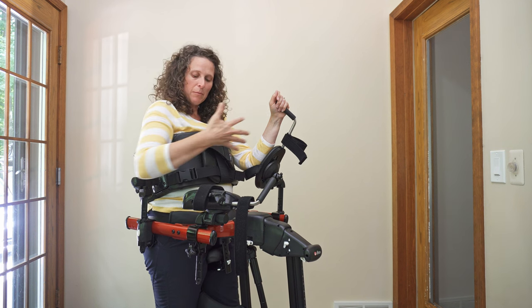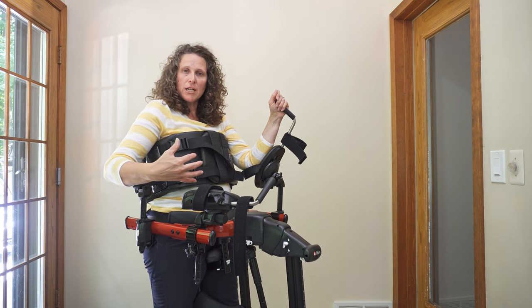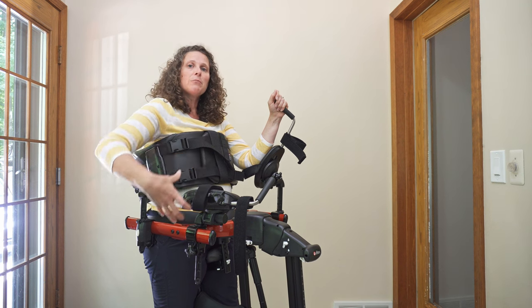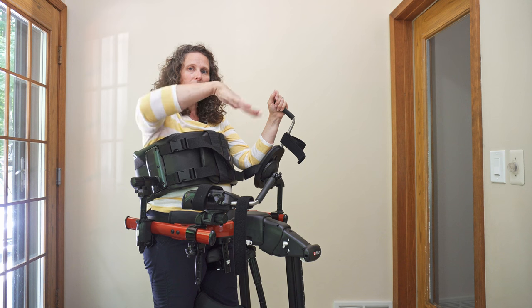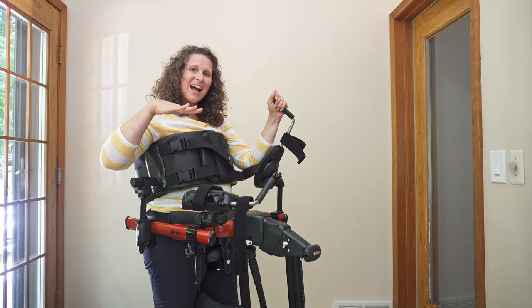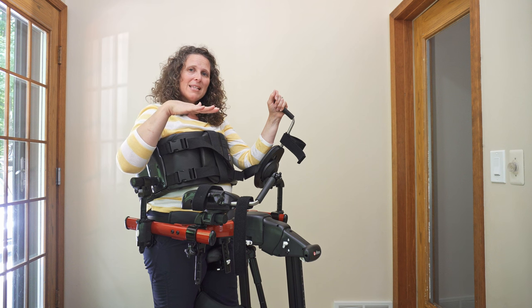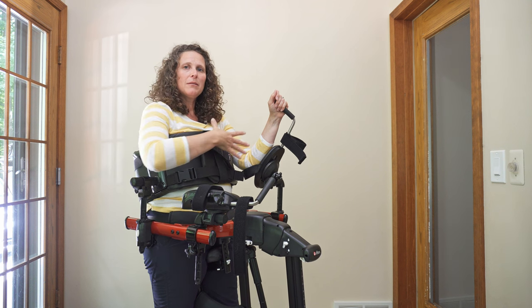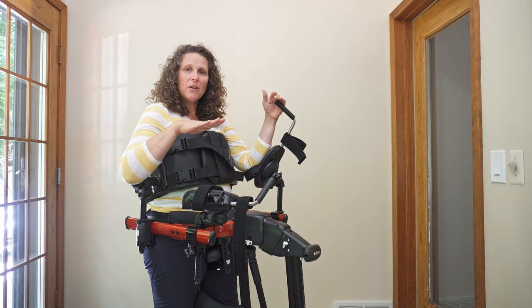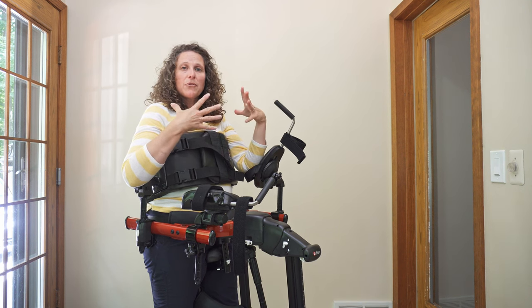As they become more comfortable in this position, you can play around with the position of the chest prompt on the frame. As they progress, you can play around with the angle of the pelvis and the position of the pelvis on the frame.